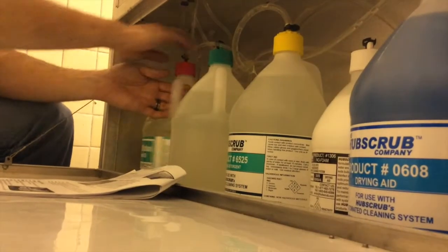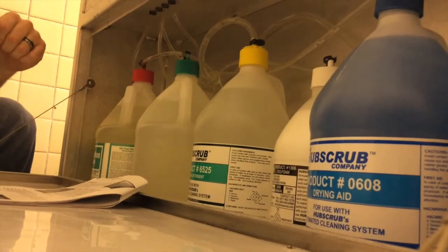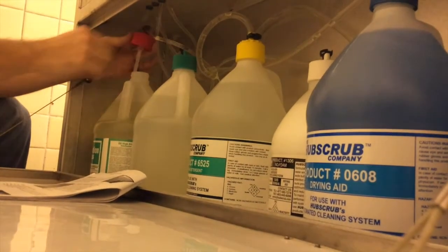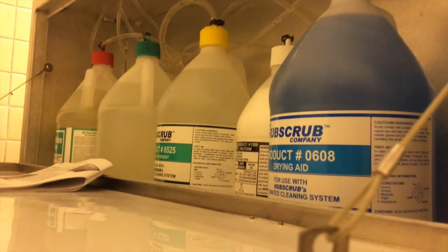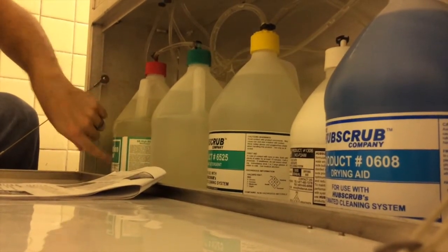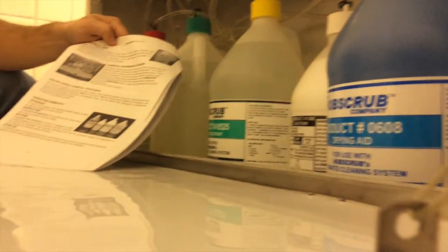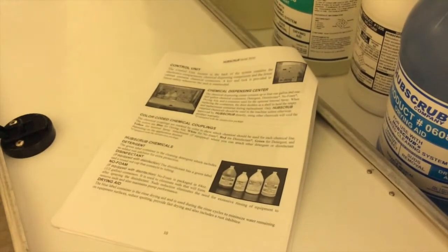The yellow cap is for the hose to do something individually if you want to. It's got these little couplings that fit on there. When something gets low, there's another page that will tell you what the flashing lights mean. You just pop it out — it's got like a straw, you pull it out, take the empty jug out, put the new one in. So the cap never changes. The cap is always attached to the tube that goes into the hub scrub; all you do is change the bottle of the solution.